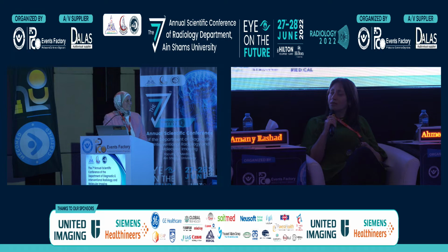Yes, the urologists are still resistant to MRI and they recommend the CT for staging and they do the cystoscopy. But we are trying to convince them. CT for nodal staging is better, and for abdominal staging, but not for discrimination between muscle invasive and non-muscle invasive bladder cancer. It is for nodal and extravesical staging.